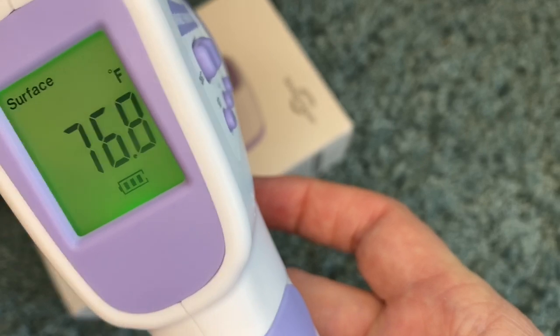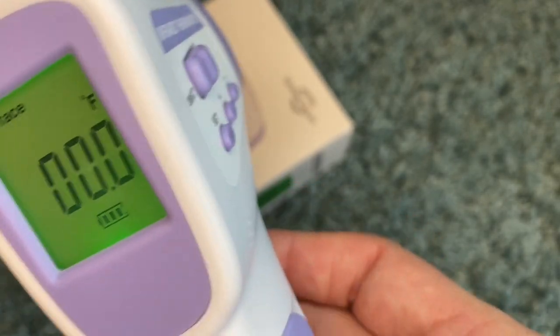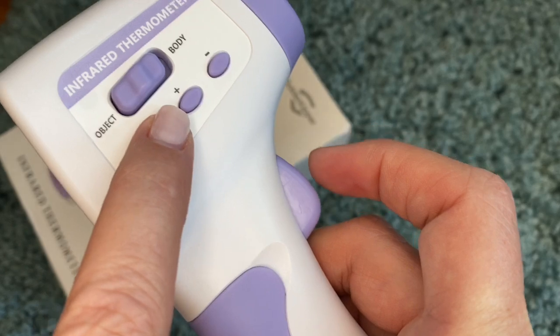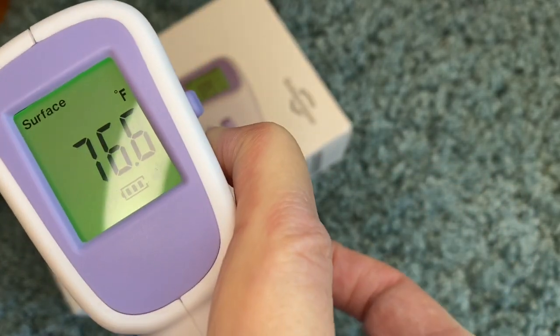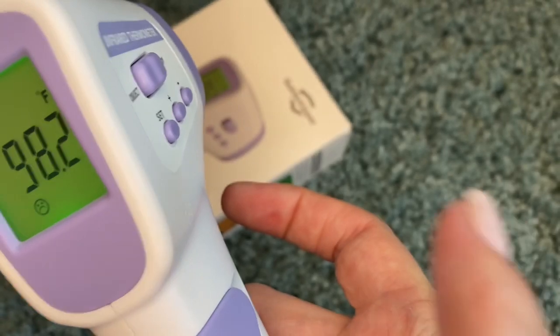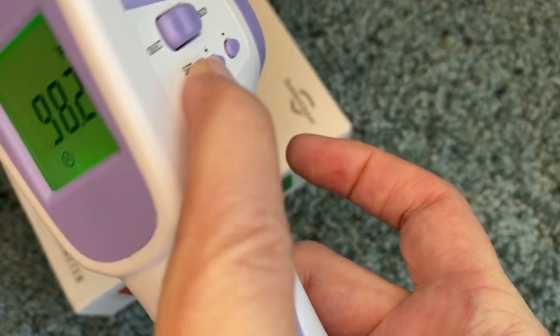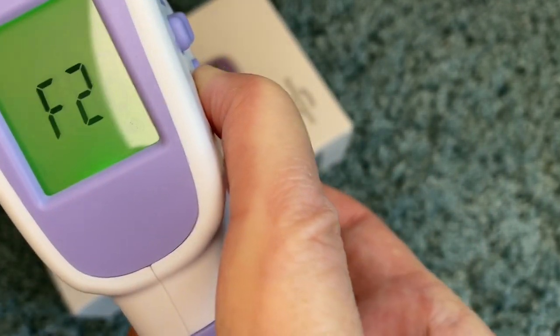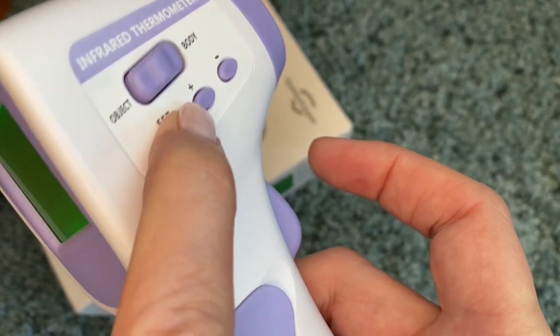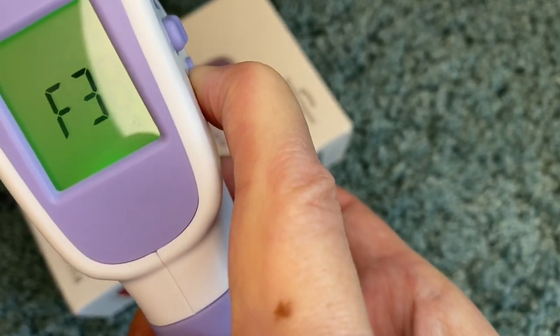It's kind of hard to video these screens but I'm going to show you. So you're going to pop it on and then this setting button right here — you're going to push and hold down until it changes to F1. Then you're going to release it and push it and hold it down again and it will go to F2. You're going to release it and push it down and move it to F3.